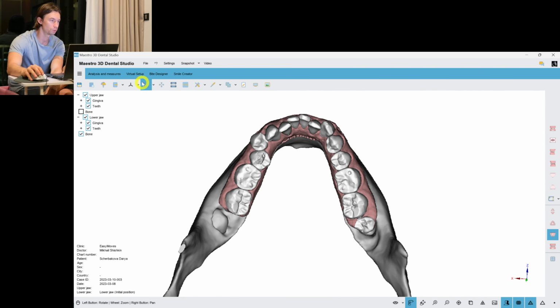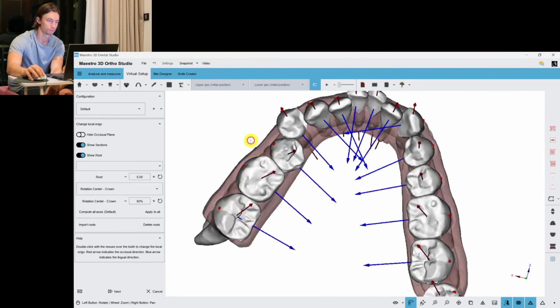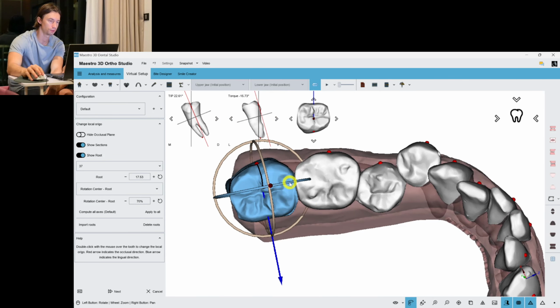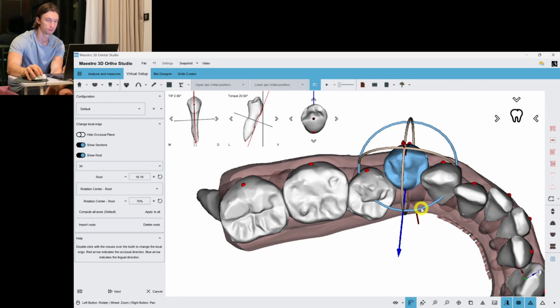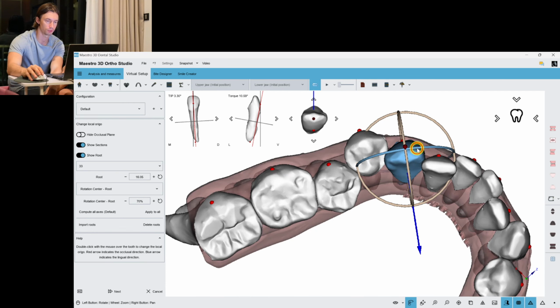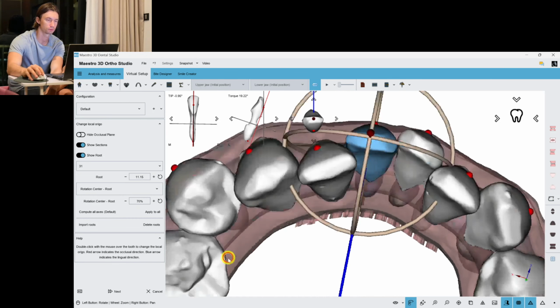And as usually, we start with this step called change local origo. And here we check the axis of the teeth. My technician has already done some preparations, but he is not very accurate with the roots positioning.